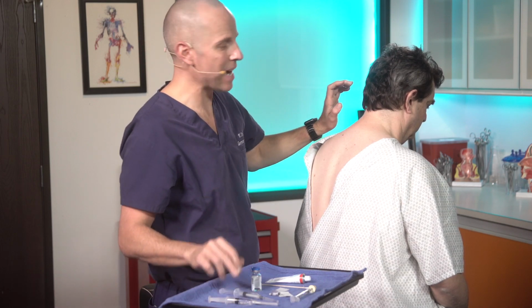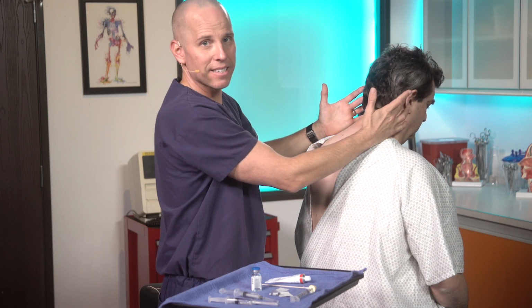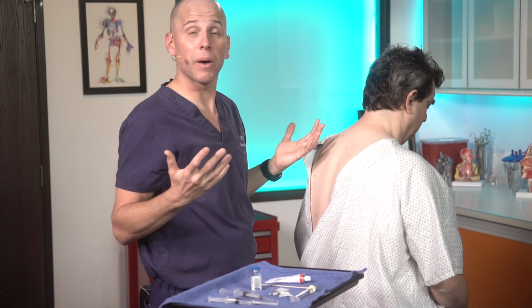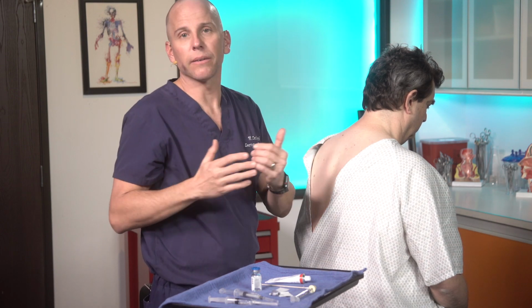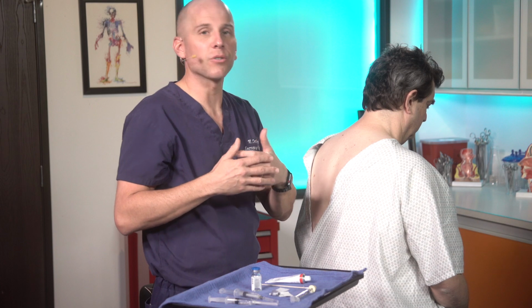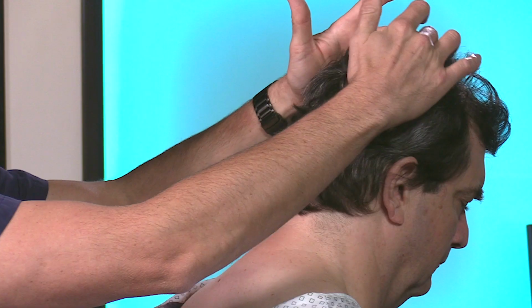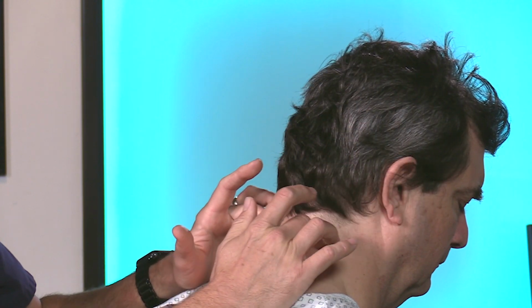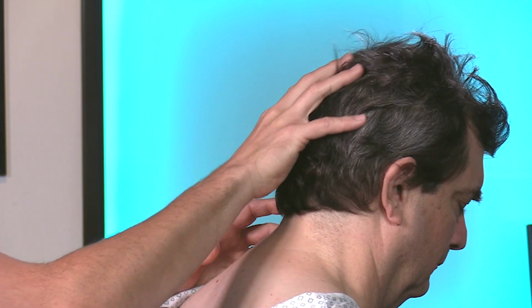So now you have the bilateral aspects, and I'll leave the patient here, come back in 10 minutes, and ask them if their headache's better. If it is, great, I'm sending them home. If it's not, well, then I can move on to my traditional oral or IV medications. Oftentimes, the patients also say they feel numbness in this area. That's absolutely normal because you're doing a nerve block for the sensory. So they should sometimes feel like, oh, the top of my head is asleep. And that doesn't last very long. And in reality, they're just happy to not have any more pain.